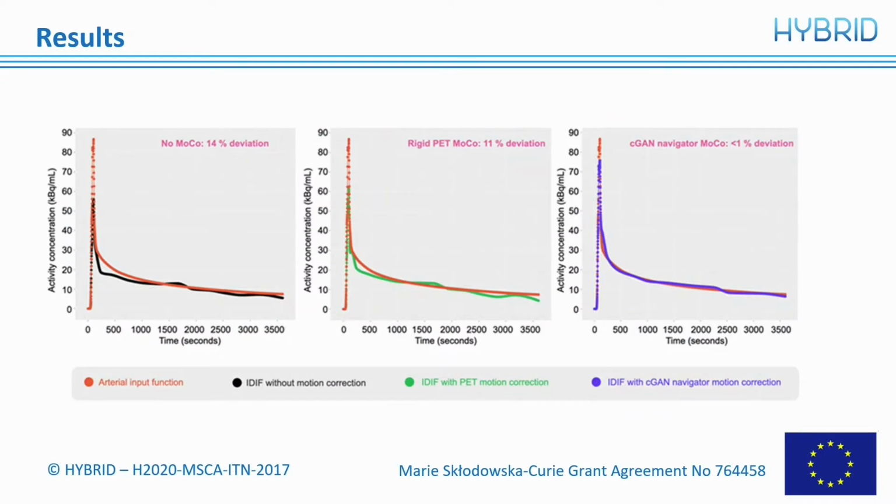We validated PANDA by deriving first the image-derived input function, and we compared results with and without motion correction, with motion correction based on pre-processed PET frames and PANDA PET frames. We achieved less than 1% deviation from the ground truth with our technique.